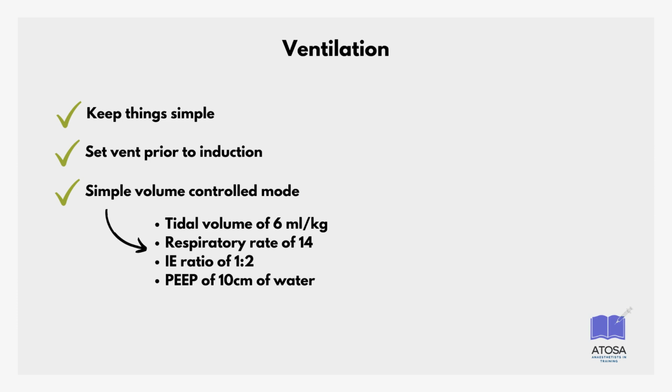Your compliance will change as the abdomen is opened and the baby is delivered, and a volume control mode is the best way to stay on target. When things have settled, you can always switch to a pressure-controlled mode if you're comfortable with that mode of ventilation.